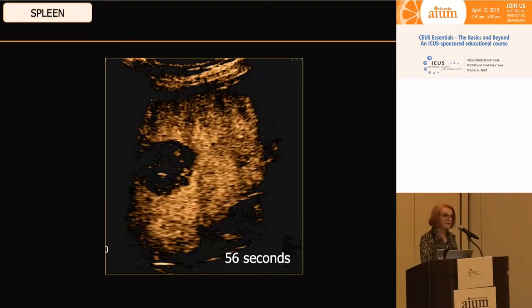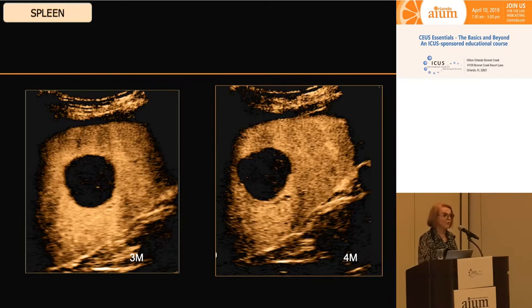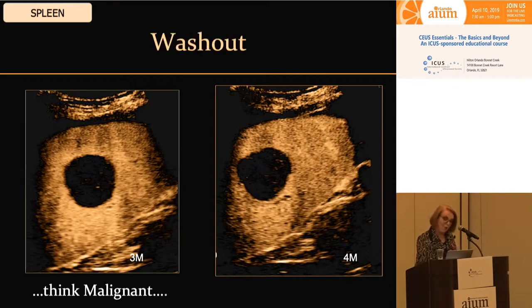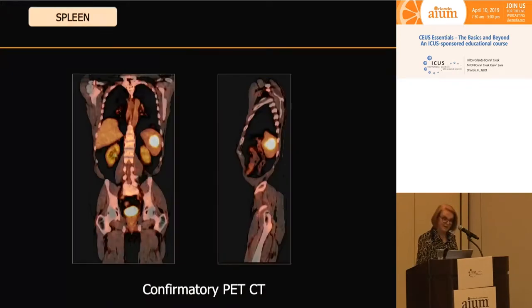We took those nice AP images from backing up the video clip, and then continued to watch. At 56 seconds, we see an obvious washout lesion washing out fast. Even though there isn't published validation information about washout in the spleen, washout always concerns me, especially when we have nice arterial phase vascularity that disappears quickly. Washout always makes me think malignancy is possible, so I recommended biopsy — and that is a B-cell lymphoma.